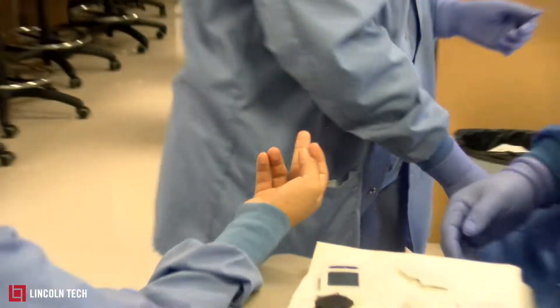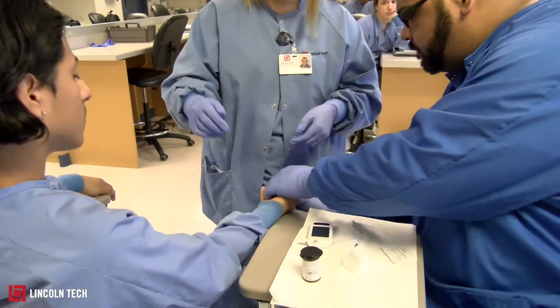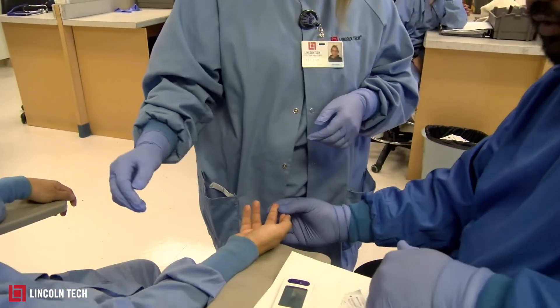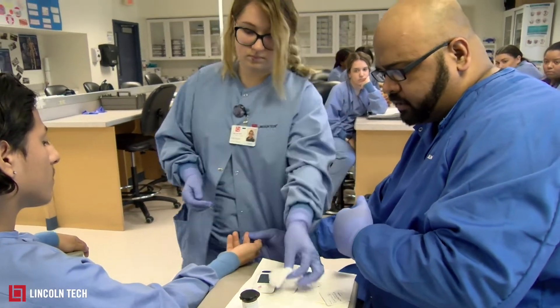She's going to throw the lancet away into the biohazard, and then let gravity play its part — bring the finger down. Squeeze a little bit to let the blood come out, and she's going to wipe away the first drop of blood, because it contains bacteria and could mess up the glucose reading.